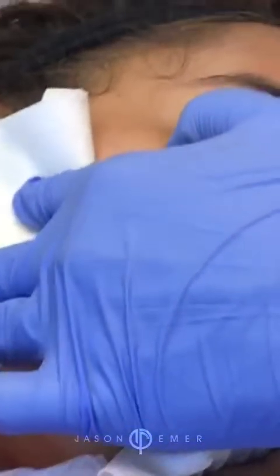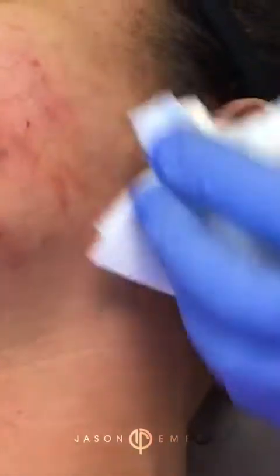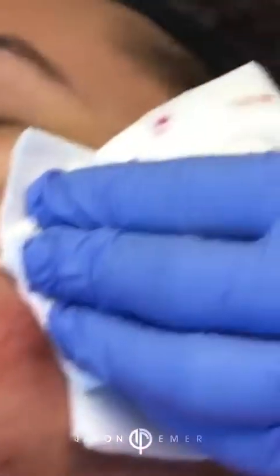Have her hold with your right hand. Hold a little pressure right there. We're now going to go back to the opposite side. After I've done a couple, take that down. Go ahead. Perfect. After we've done a few needle pokes, we can see now. Shine for me a little bit. Smile for me. So why do I have her smile? Can you wipe a little alcohol? Why do I have her smile?